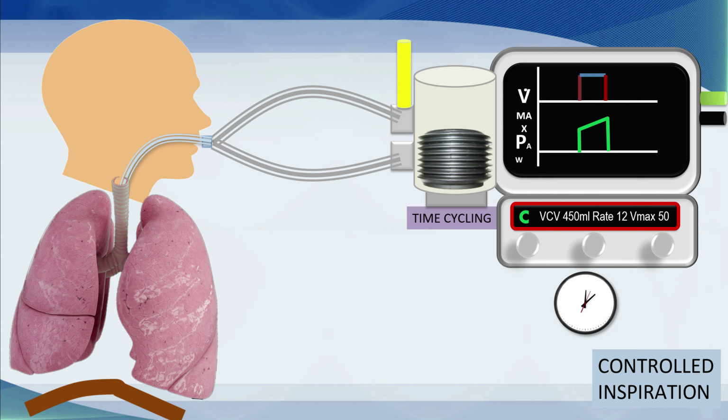Gas passes from the inspiratory tubing, and in this case, it goes all the way into the endotracheal tube and into the lungs. The lungs inflate, and the diaphragm and chest wall move down and outwards. In this situation, the chest wall, the lungs, and the diaphragm are passive. They're being pushed out. They're not moving themselves. And so the thoracic pump itself is a passive observer in all of this. And part of the role of the breath is to move all this tissue out of the way.